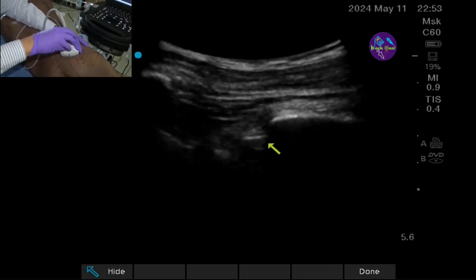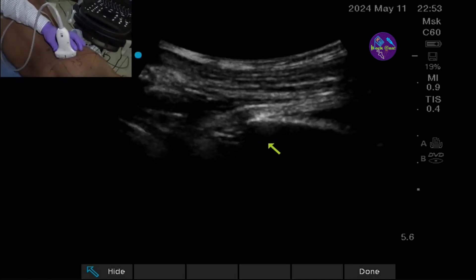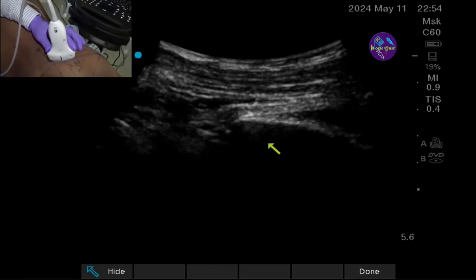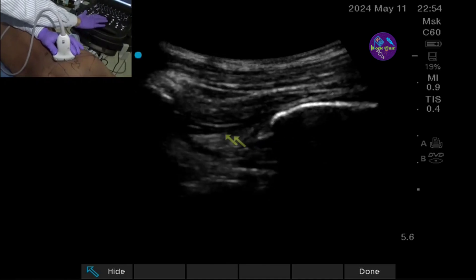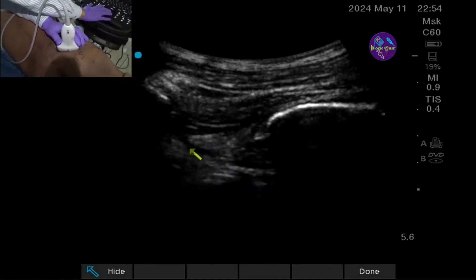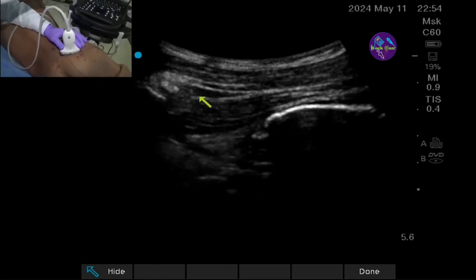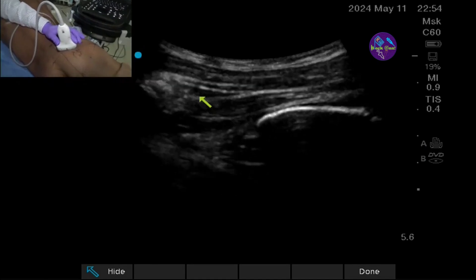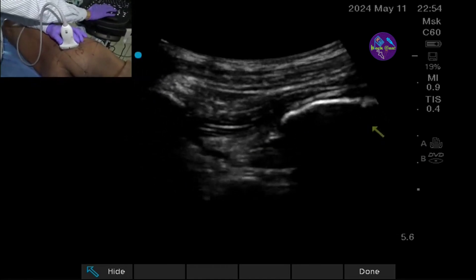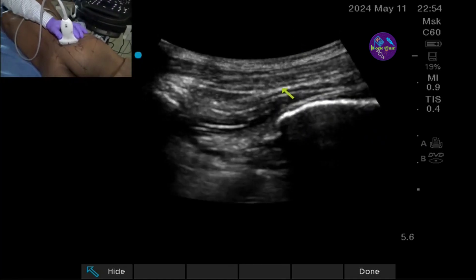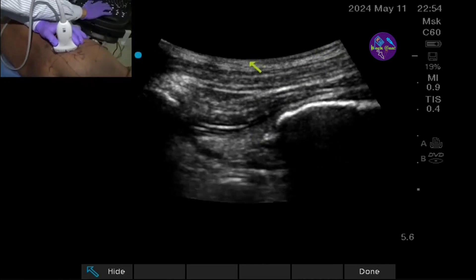If you rotate the probe caudally, you can see the longitudinal view of the sciatic nerve coming out of the greater sciatic foramen. Going back to the sacral plexus view, you can see the sacral plexus with pulsatile structures. The first arrow indicates the superior gluteal vessels and the second indicates the inferior gluteal vessels. We will approach from the lateral area towards the ischium to avoid direct injury to the vessels, using an in-plane or out-of-plane technique.